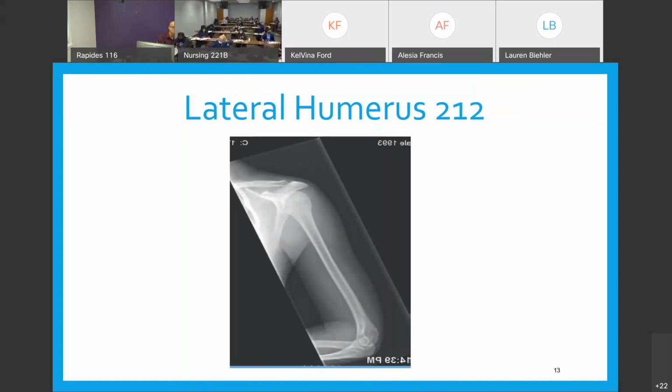Perpendicular on the image. They will be what? Superimposed. It's not rocket science. You know this stuff already. Look how good you're getting at it. So we're focusing on the elbow because that's what we already know.